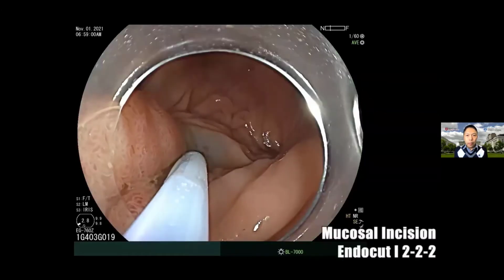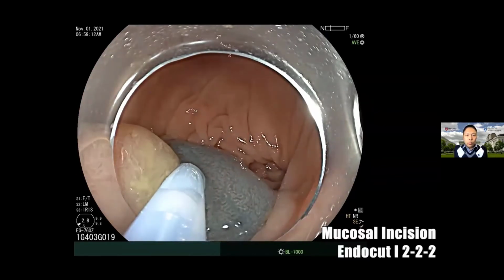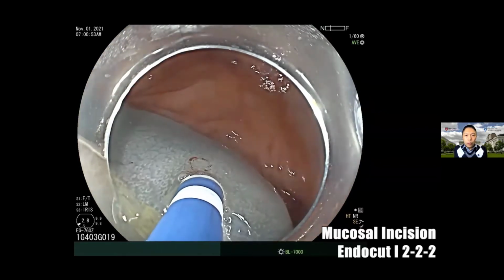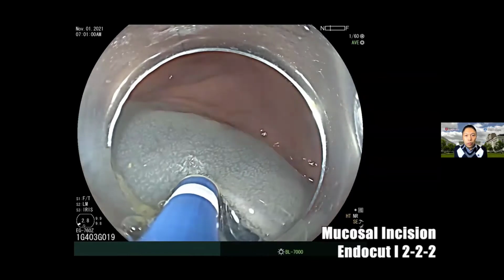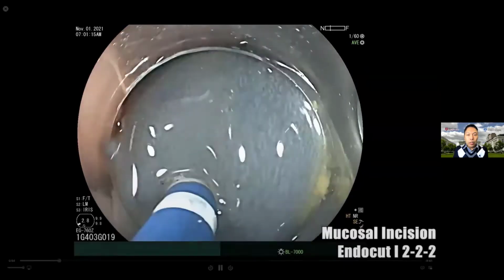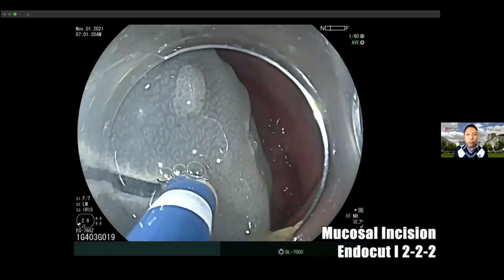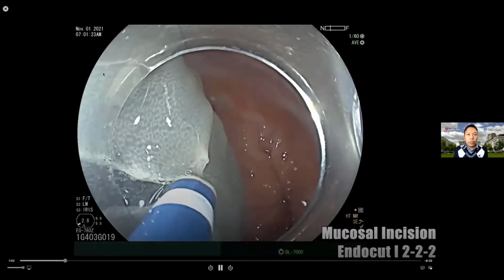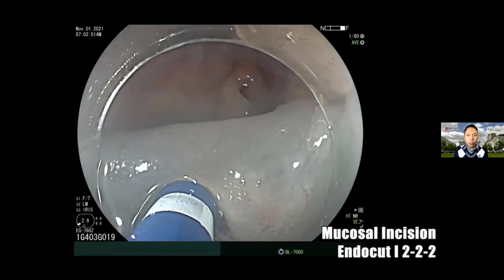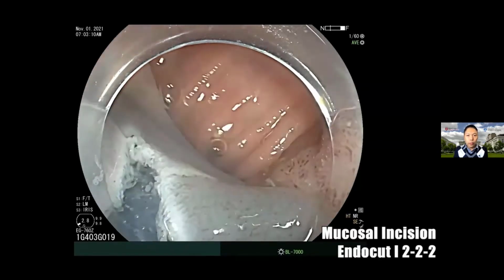see any invasive pattern. So if you want to use the traction technique, basically we need to finish the full circumferential mucosal incision first. This is because if you do not finish the incision at the oral side of the lesion, you won't be able to finish the incision at the end. So usually in colorectal ESD, we try to avoid any full circumferential mucosal incision to avoid any leakage of the injected solution. But if you want to use the traction technique, the basic principle is to finish the full mucosal incision first.